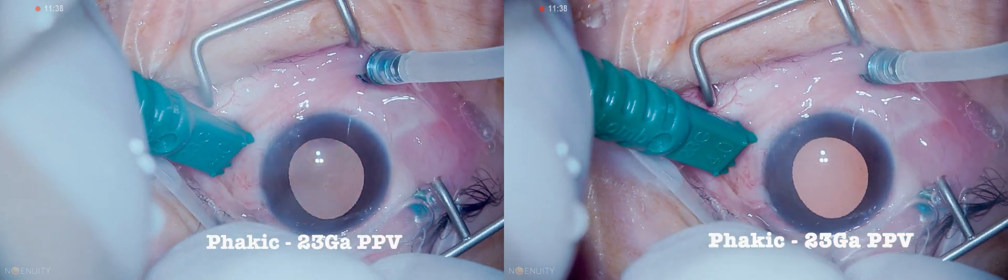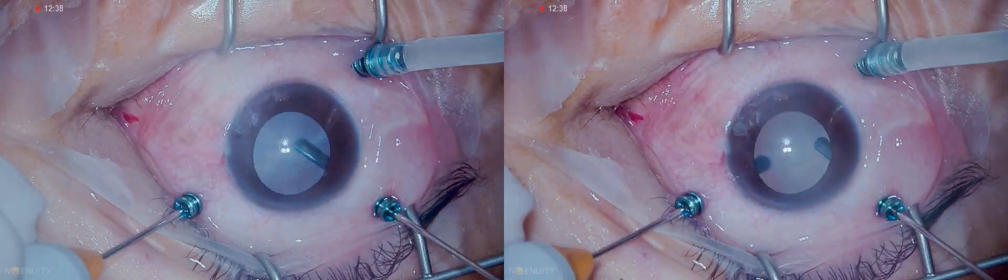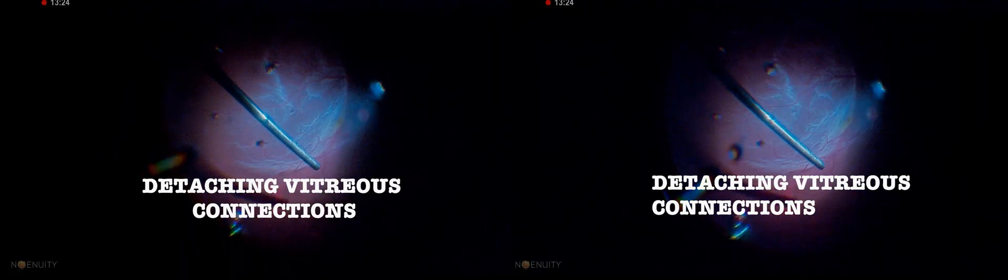A 23-gauge pars plana vitrectomy is set up. The lens is pretty clear and it is a macular-off retinal detachment. Vitreous attachments are removed and the retina gets more mobile.